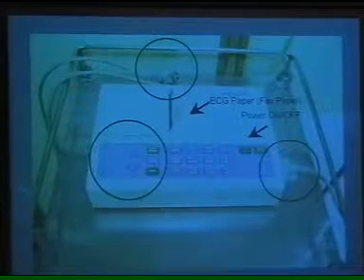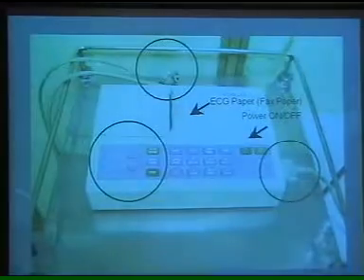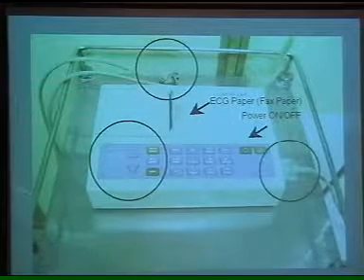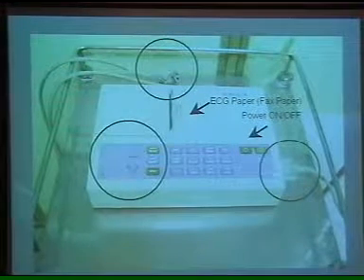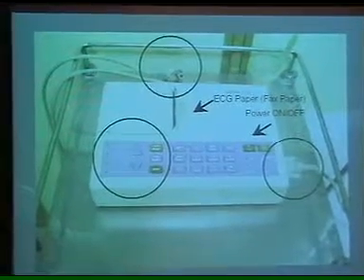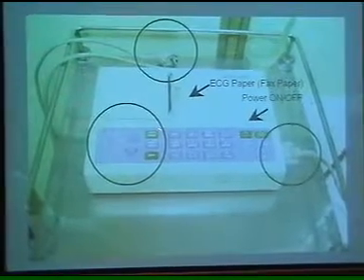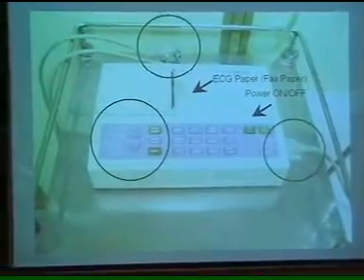Let's come to the slideshow, which is the main purpose of this presentation. ECG machines are different models. The new ones, the expensive ones, are automatic. I've chosen a simple machine which is available in most places. It has a few panels of buttons, and a slit from which the paper comes out when you start taking the ECG. The power switch is there in all ECG machines, where you can switch on and off, and there is a panel of buttons from which you can choose the leads.